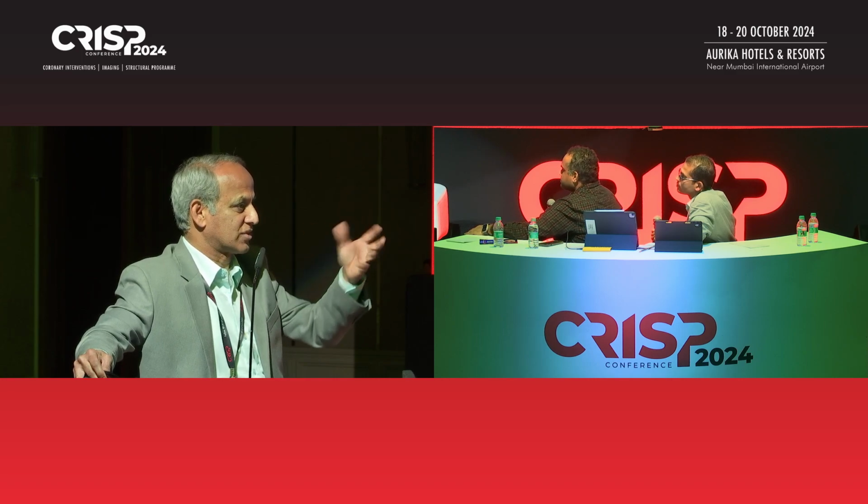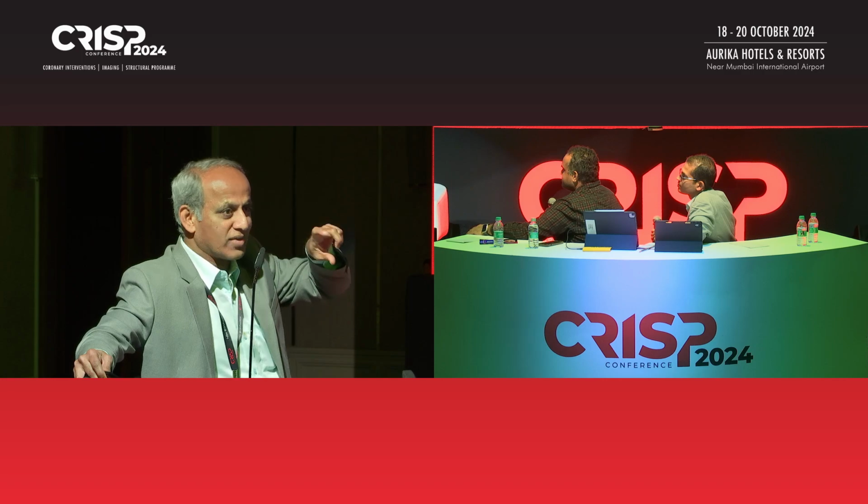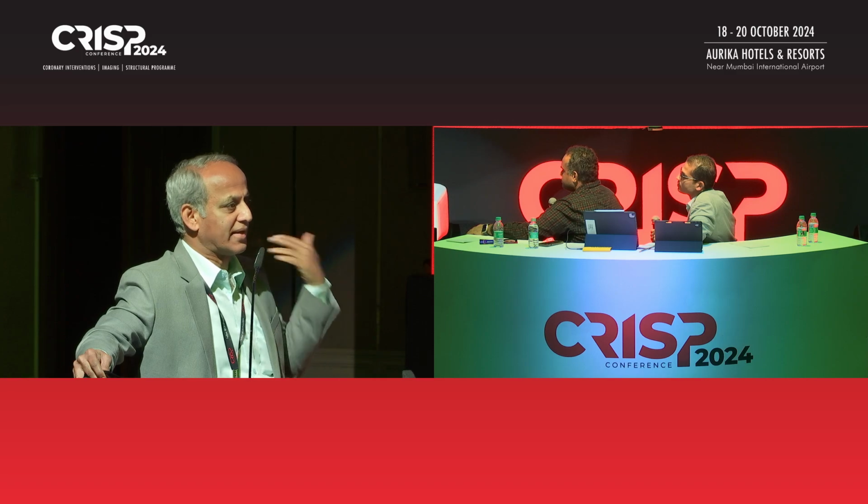And I think we should make films out of that also, what entrapment of the chordae is. And you should never ever accept that and come out. You will end up getting acute TR on table here. Any thoughts on retrograde closure?